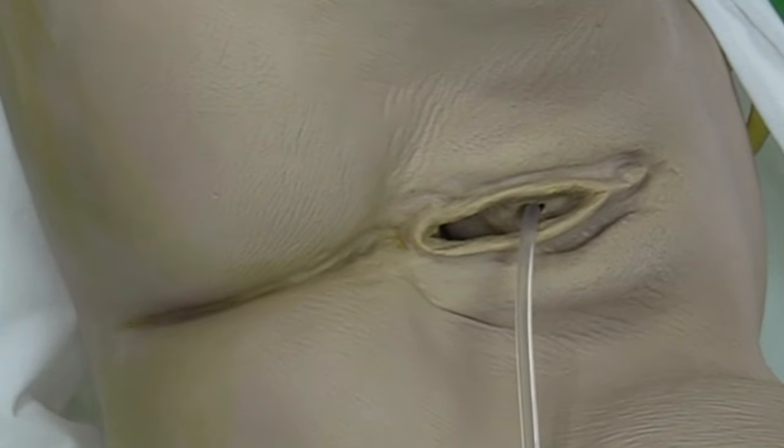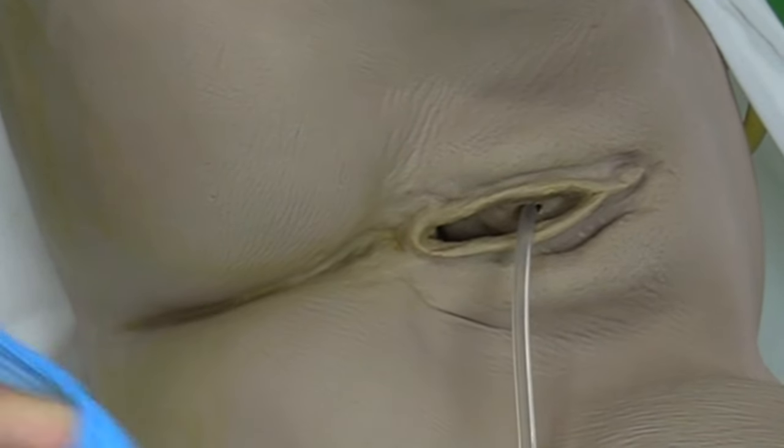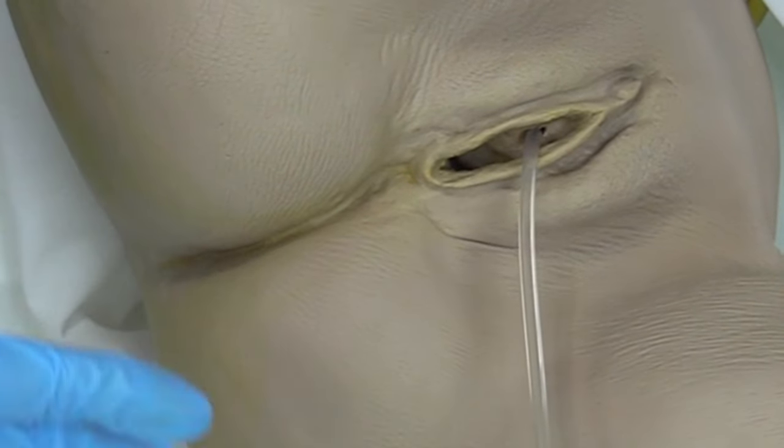After you've done that, just make sure your patient is okay on their side, and then quickly you want to doff your gloves and perform hand hygiene and don a new pair. Then once you have your new clean gloves on, you're gonna assist the patient back into a lying position, make them comfortable, and then you're going to perform cath care.